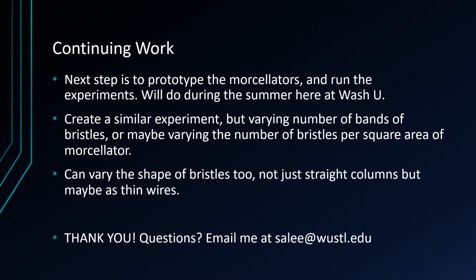So continuing on, my next step will be to prototype and create these morcellators either through 3D printing or some other kind of manufacturing, and run the very experiments, which I will do during the summer here at WashU with my fellowship at SINT.